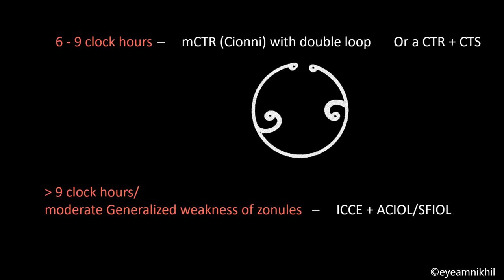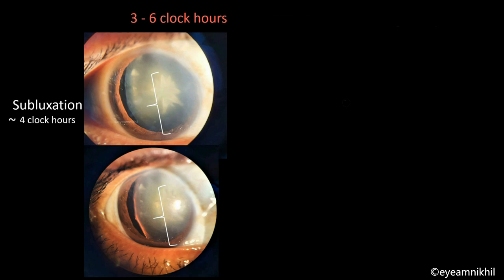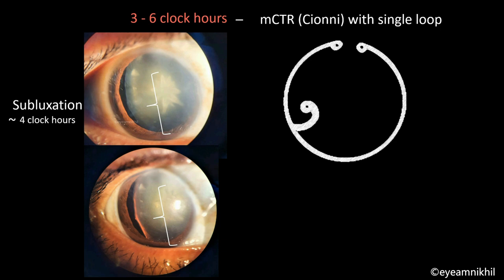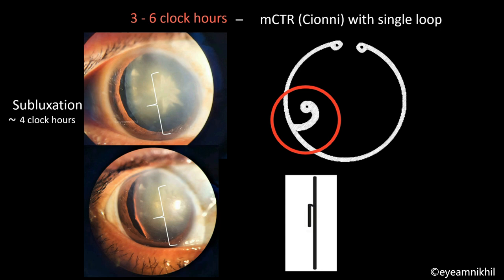This patient had a subluxation between 3 to 6 o'clock hours. So the plan was to use a modified CTR with single loop, also known as the SIONI ring, named after Dr. Robert SIONI, who modified the CTR by adding a fixation hook that loops 0.25 mm anteriorly from the body of CTR so that it stays above the capsular margin. The free end of the hook has an eyelet through which a suture can be passed for scleral fixation.